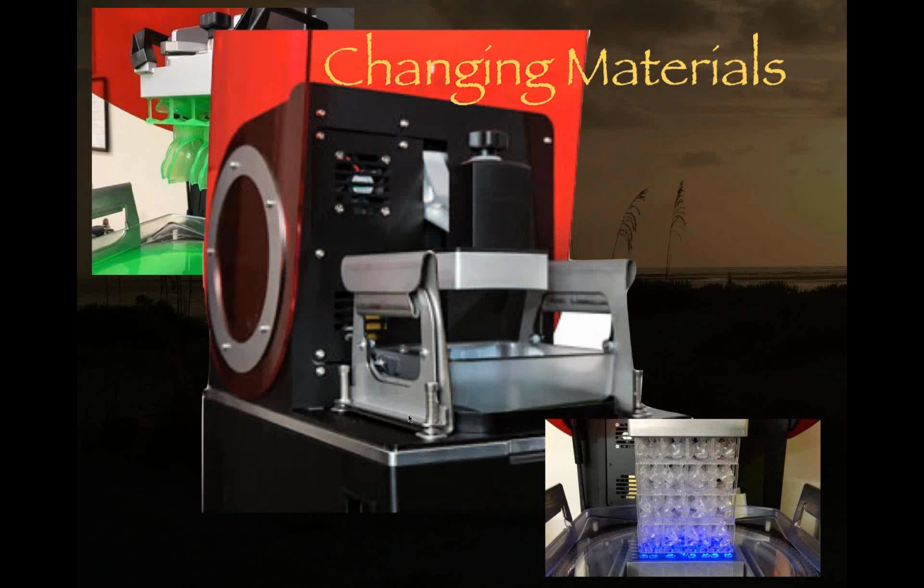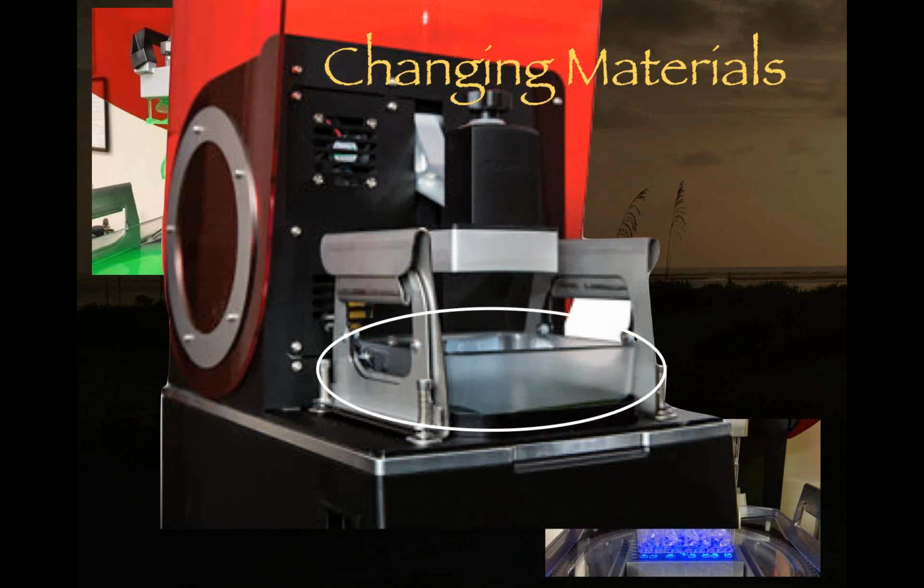The tray is just a plastic tray. You can see it here. It's mounted. There's these little grips. You just pull these up with your fingertips, and you lay these arms out, and the tray just comes out. Put a lid on it, put it in a dark cabinet, and put the other tray in.